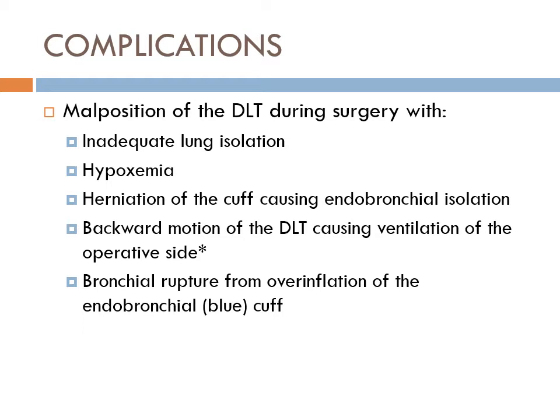But when things don't go well, what do you do in the case of this? How do you recognize these things? So we'll start talking about some of these things. Inadequate lung isolation is going to be something that is going to frustrate the surgeon, but if you're not adequately isolating the lung, you're also slightly ventilating the lung, and that's what that means.